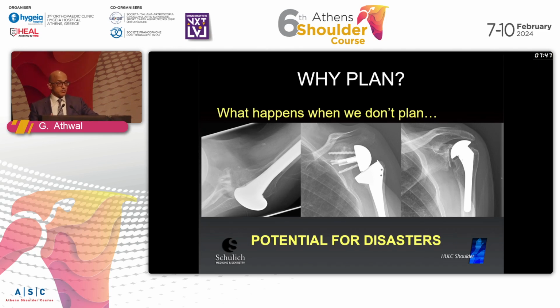The second case is my case. It was 2008. I was experimenting with the bio-RSA. You can see I put the baseplate in superiorly inclined, and I translated the baseplate high, and look at the pretty impressive amount of notching that I have, which should not happen when you do a good bio-RSA. In the last case, you can see this was a very conservative head cut. If the surgeon had taken the time to actually identify how thick that head cut would have been, this would have been a preventable problem.